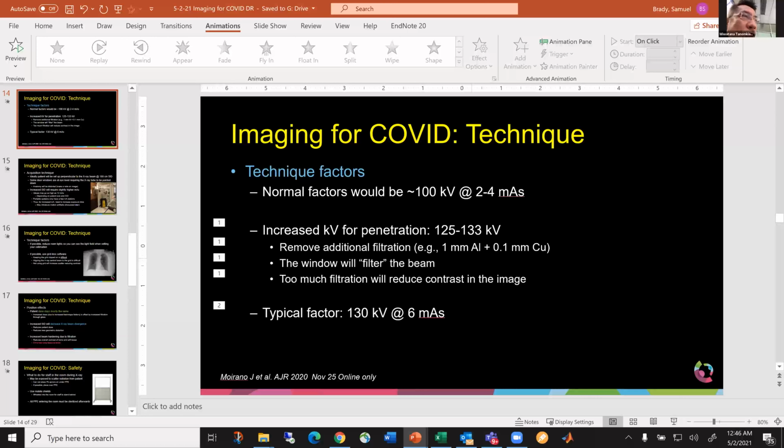So I think the patients in the field hospital, we don't expect to see big things in the chest. We would like to see very subtle, very faint findings, very subtle increased attenuation in the lungs by observing the sharpness of the lung vessels, something like that.